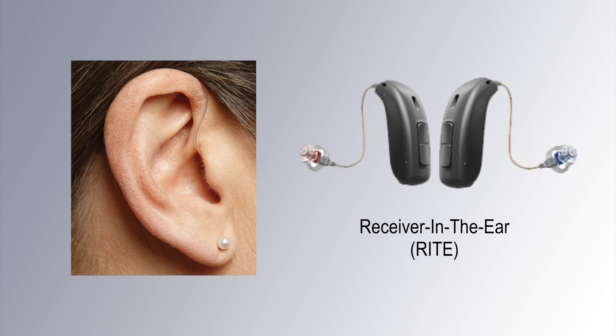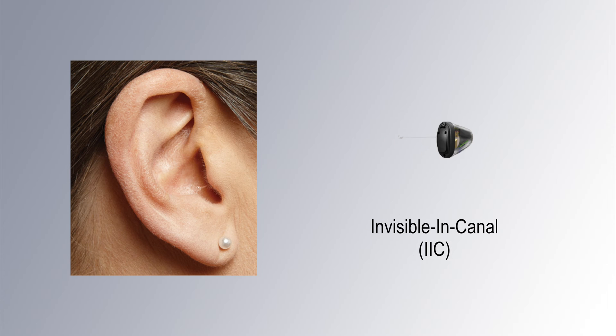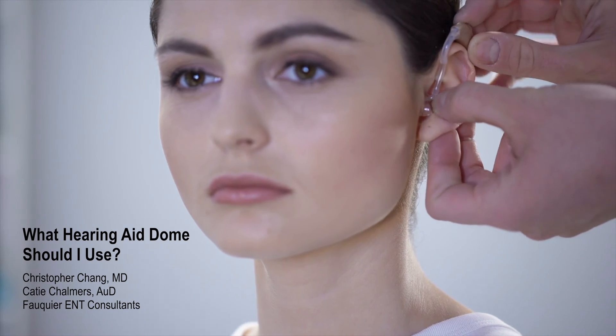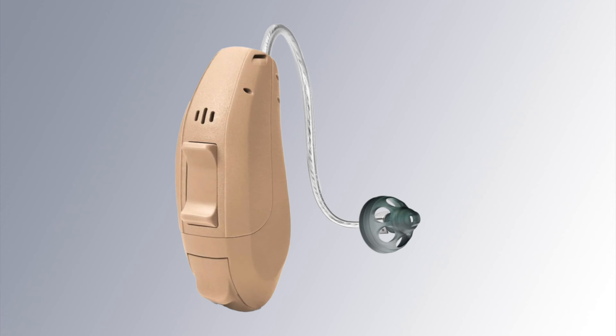Purchasing a pair of hearing aids is only one of many factors that must be considered in order to hear one's best in spite of hearing loss. Other factors that need to be addressed after hearing aid purchase include programming and physically fitting the hearing aid to the ear canal. In this video, we will focus on hearing aid fitting, or how the hearing aid is coupled to the ear canal.